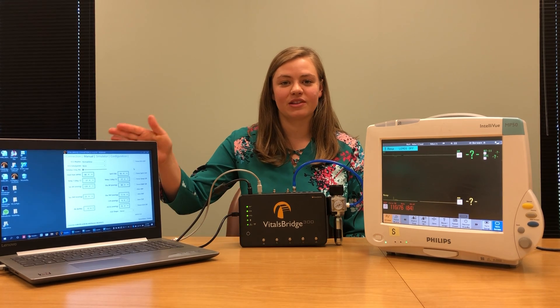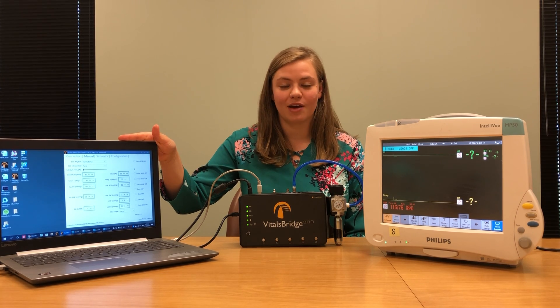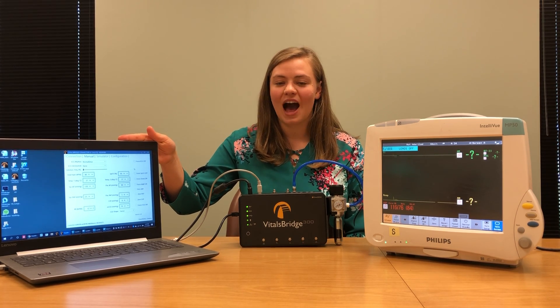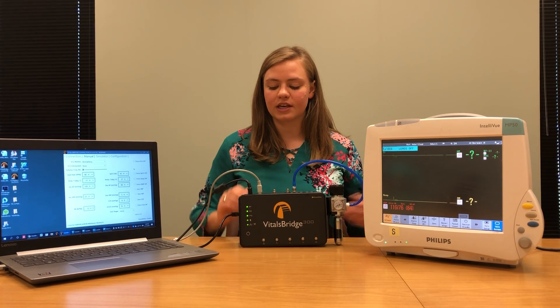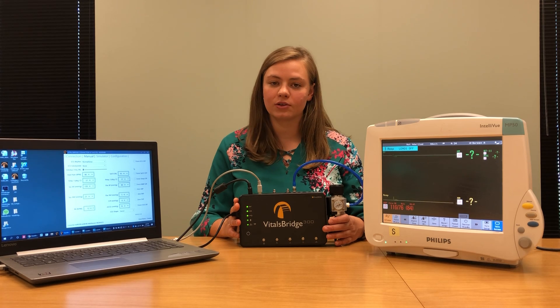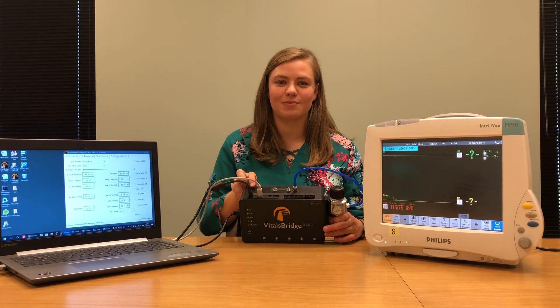Before beginning, I downloaded the VitalsBridge connector software from VitalsBridge.com/downloads to my computer. I also connected my VitalsBridge 300 to my computer. To do this, I used a USB cable that was included with my VitalsBridge and I plugged it in here and into my computer.